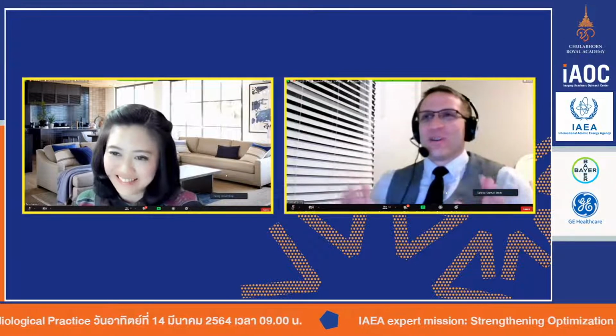It's going to look really noisy because we set the dose knowing that eventually we're going to take those 0.5 millimeters and create 5 millimeter or 8 millimeter, however thick, thicker sliced images. When you create thicker images, you're averaging more data, and more data averaged together reduces the amount of noise in the image. It's signal to noise ratio. You get more signal, so that little bit of noise just kind of disappears in the image.